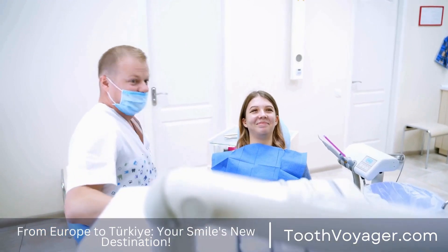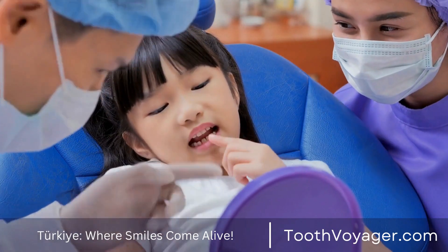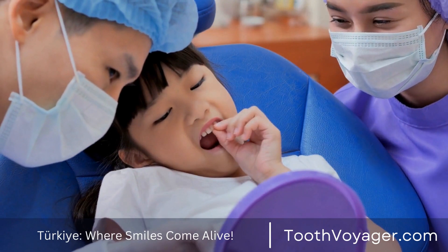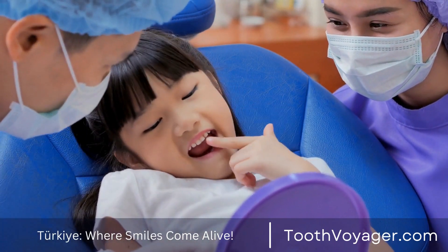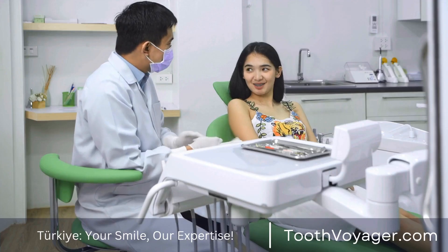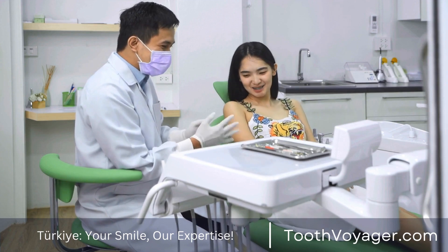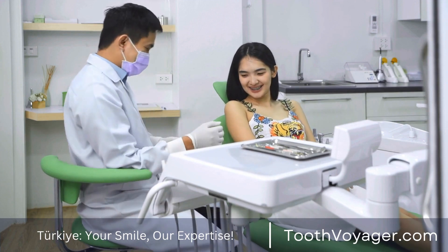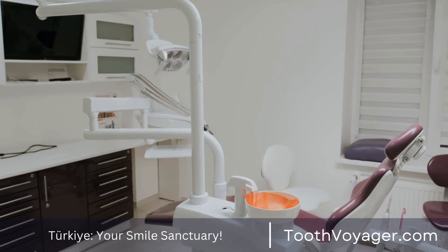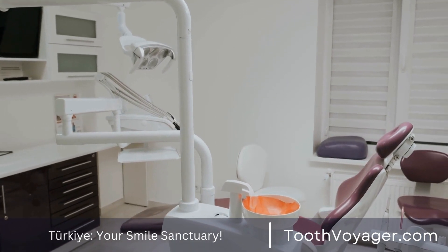Adjustments and Final Results: When the veneers are attached to the teeth, the dentist can make required adjustments to ensure flawless alignment. This may include trimming or polishing the veneers so that they blend perfectly with the natural teeth. When the necessary adjustments are done, patients are able to take pleasure in their new look.